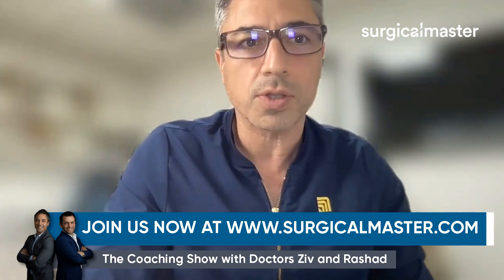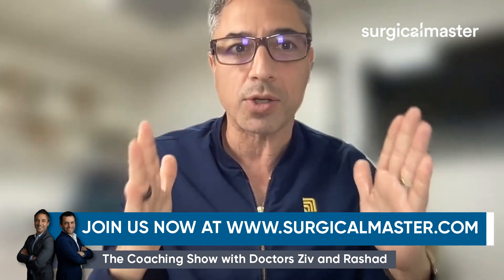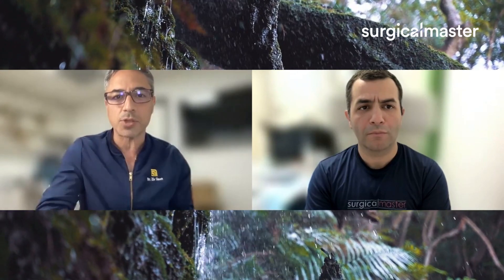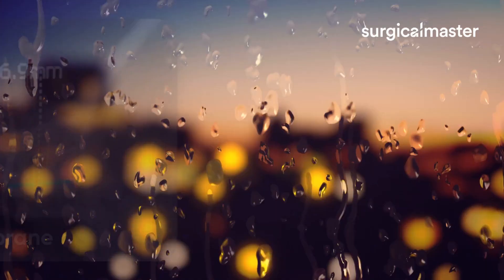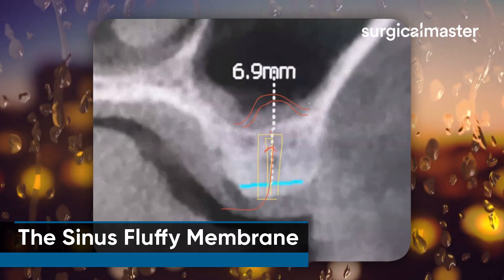Once you've found the floor, start expanding it to three up to four millimeters of diameter. Then add your two scoops of bone graft, gently tap them in, keep tapping, and take another x-ray. And if you see the dome developing — awesome, you're there.